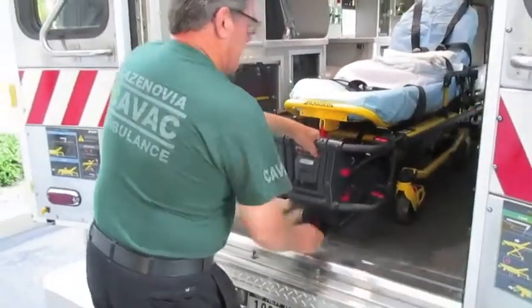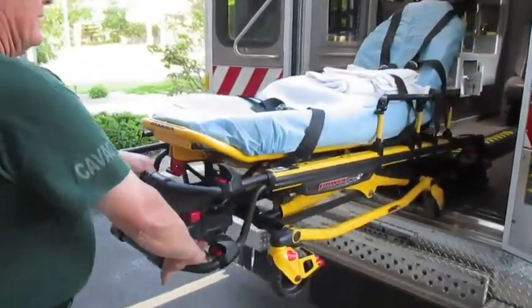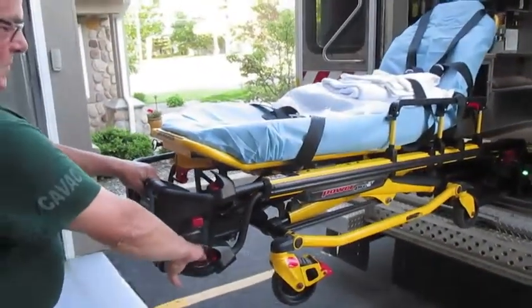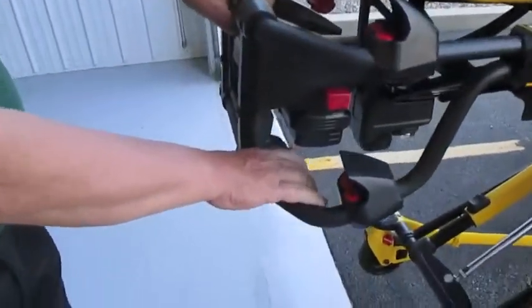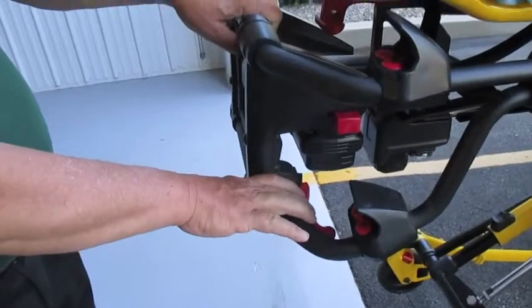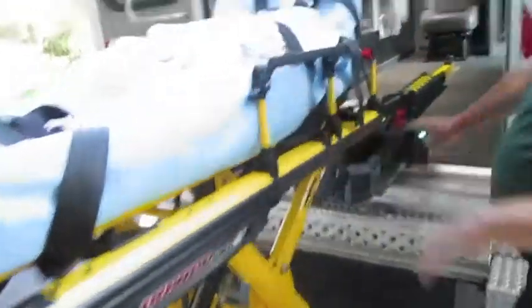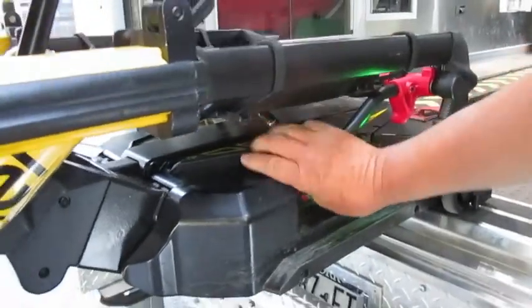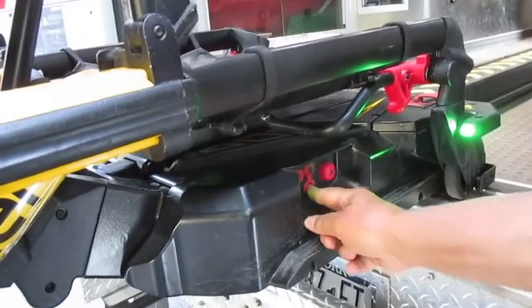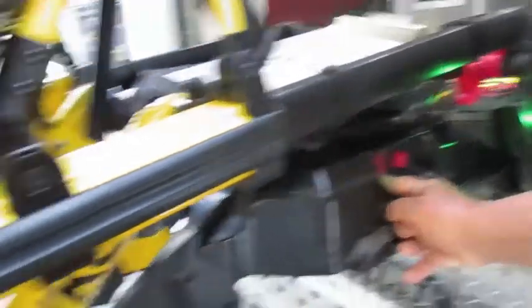This is the dead stretcher — absolutely no connection. We're getting the indications. We're going to use the auto release, put the legs down, and we're going to use the manual controls on the lift itself to lower it. Watch your fingers — watch your fingers — and release. Everything moves, everything goes down.